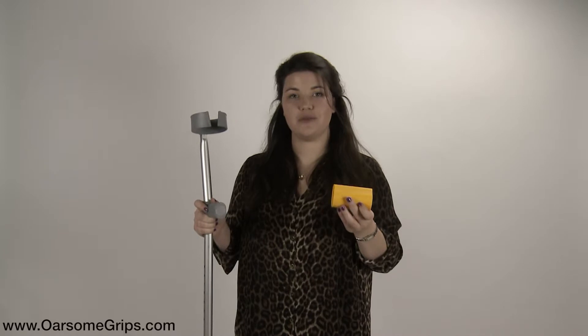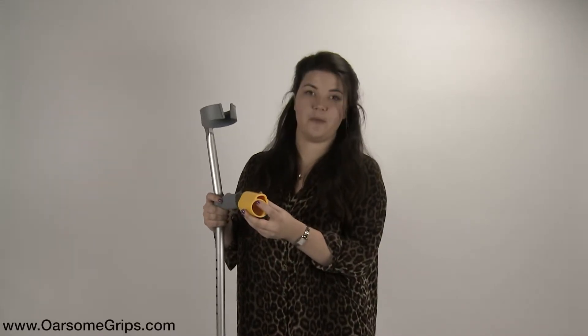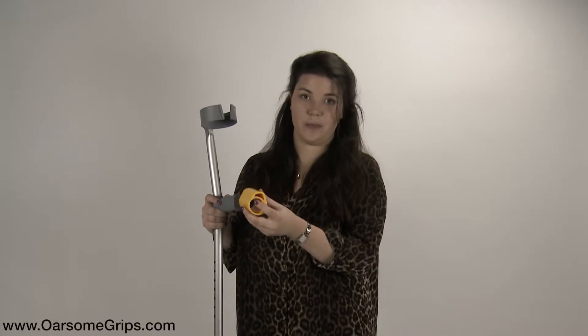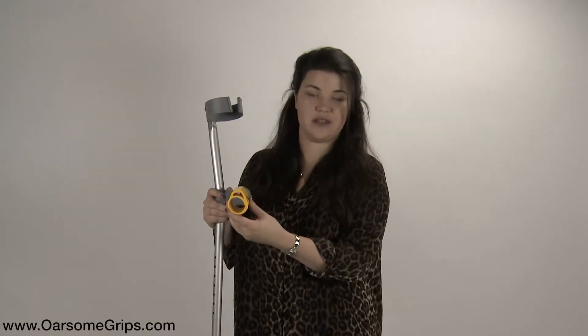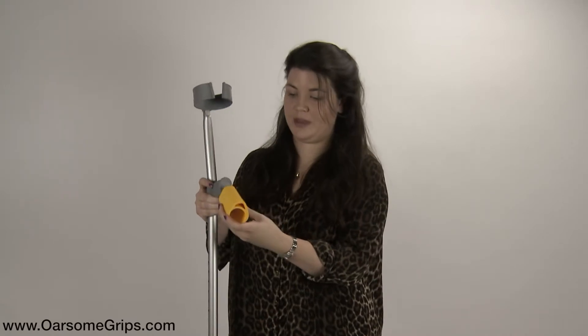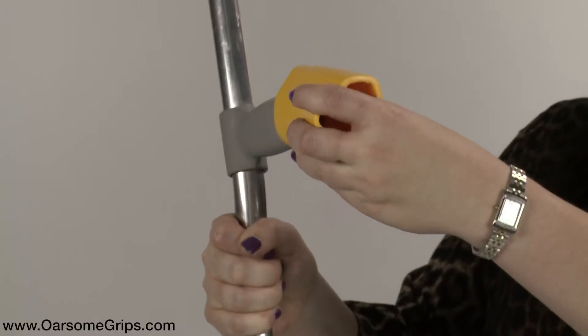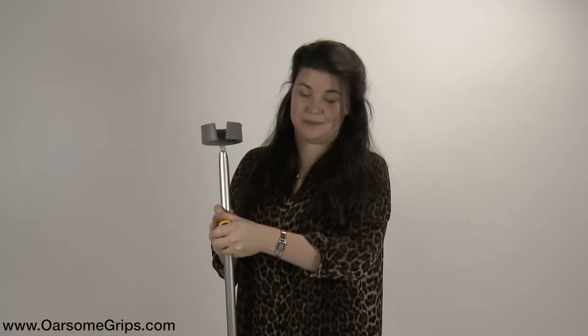Once you've removed the Awesome Grips from their packaging, align the round hole with the crutch handle. Make sure that the shock absorbing part of the grip is always at the top. At this point, you can either fit them with the logo facing away from you or towards you, depending on which is most comfortable for you. Once they're aligned, simply push them on over the top and with a bit of a wiggle, they will fit.